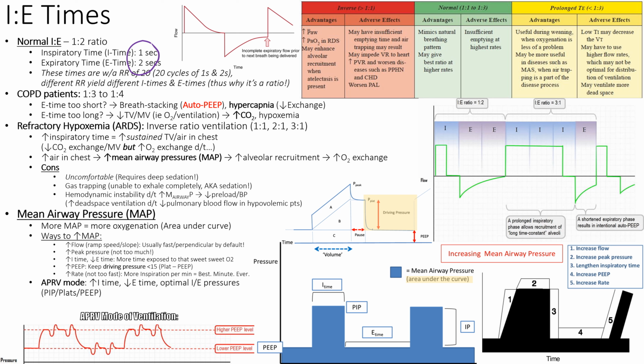So the risk of doing that is you can drop your oxygen and you can drop the amount of volume that you're exhaling, right? If you imagine if you were once doing 1 to 2 and now you're doing 1 to 3, you have more exhalation. Well, I'm exhaling more CO2, but no, really, the volume you're getting rid of is not that much, right? Your E time is being expounded upon, right? It's being extracted. What's another word? It's being elongated. I'm on an alliteration kick.